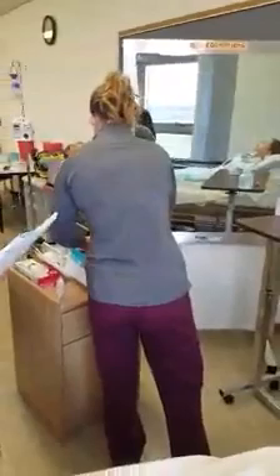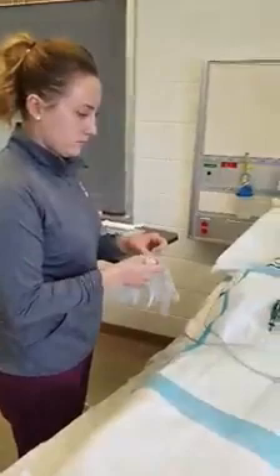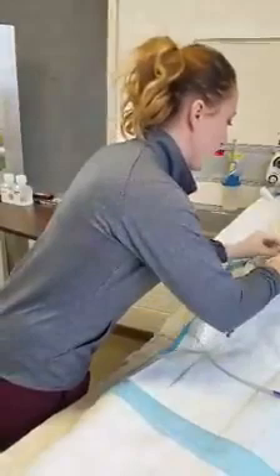She will first position her patient in Semi-Fowler's position, unless contraindicated, and place a linen saver pad on the chest. She will then don clean gloves, remove the soiled tracheostomy dressing, and then discard the dressing and the gloves as appropriate, and perform hand hygiene.